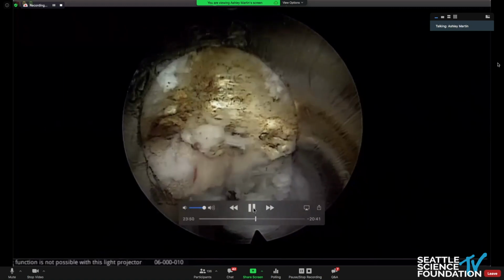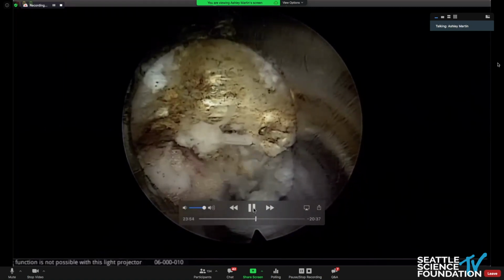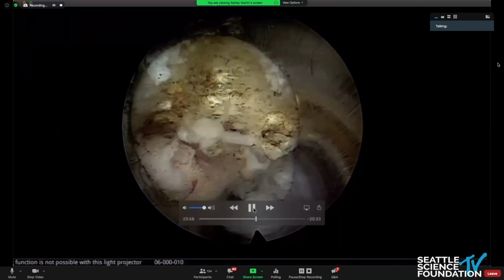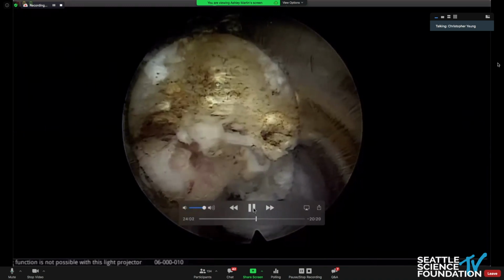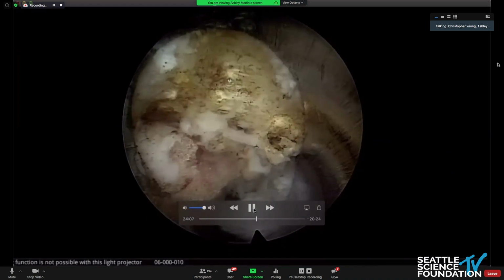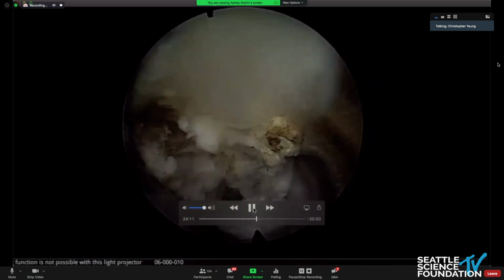The surface of the superior articular facet. Give me a picture of that. So here, at 12 o'clock, you see the undersurface of the superior articular facet and the facet capsule. You can see I burned it a bunch with the laser. It's very specific. Eloquence is what we usually use, but this is really nice. And this is causing foraminal stenosis.